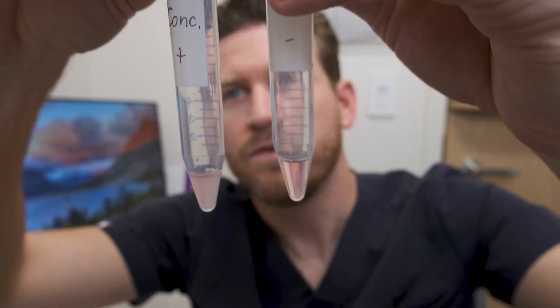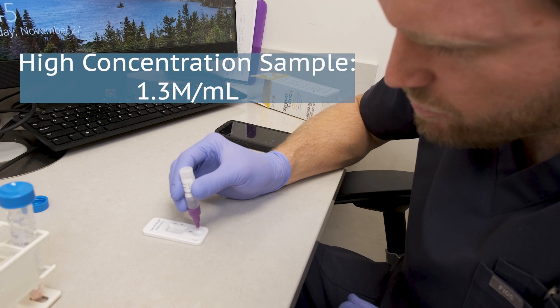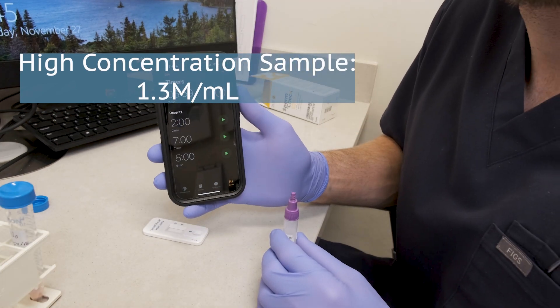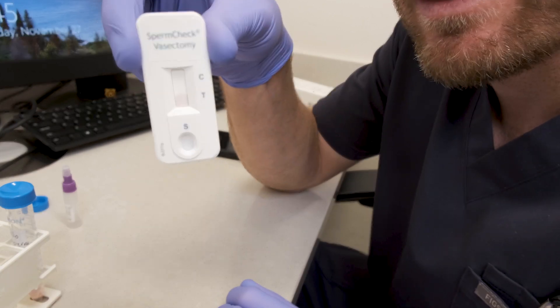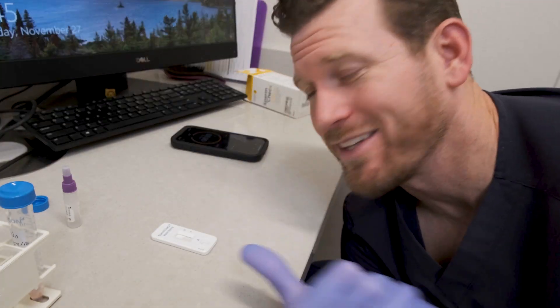This tube is our high concentration sample versus this one that has no sperm. And here's our low concentration. We'll add five drops and wait seven more minutes. You can see it's being drawn up immediately — it's working right away.